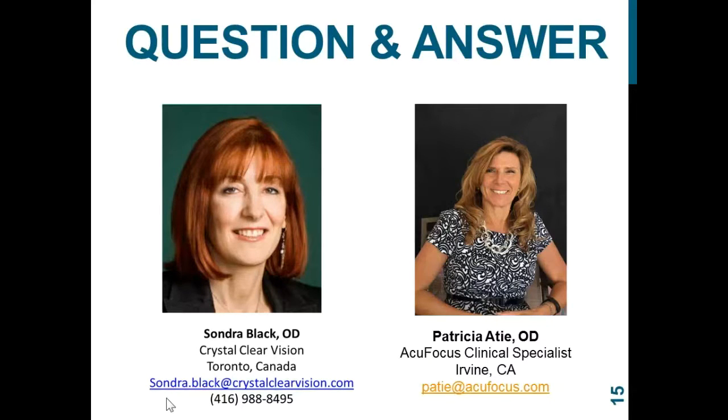Have them look at distance. They can still see their distance, just to help you understand what that is. And then, depending on the age, put that plus 75 in front of them to bring it in to better focus, just to help them understand that, yes, you do. You have some people that say, oh, I'm fine, I'll be putting my reading glasses on, but just give them that visual of, we really can get rid of all of it for you.